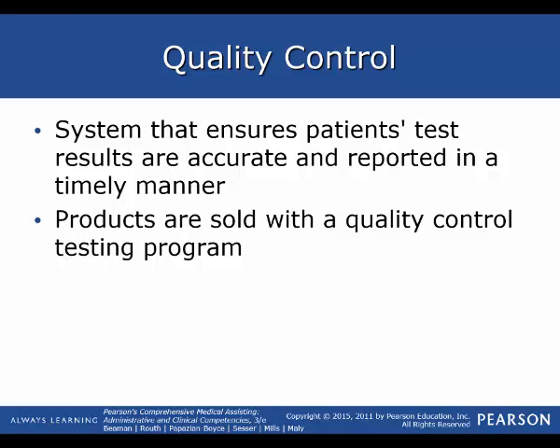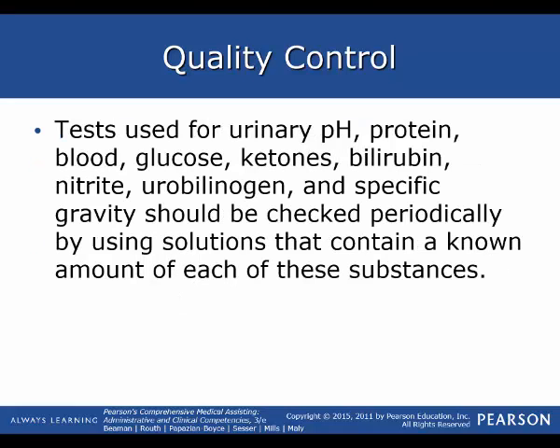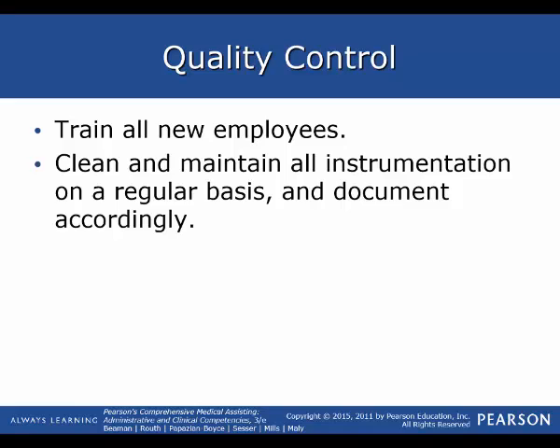Quality control is a system that ensures patient test results are accurate and reported in a timely manner. Conduct testing on a regular basis, review the expiration date before any test, and precisely follow directions. One of the most important things is to document quality control in the quality control log. Tests for urinary pH, protein, blood, glucose, ketones, bilirubin, nitrite, urobilinogen, and specific gravity should be checked periodically using solutions that contain a known amount of each substance — your control substance. Train all new employees and clean and maintain all instrumentation on a regular basis, documenting accordingly.